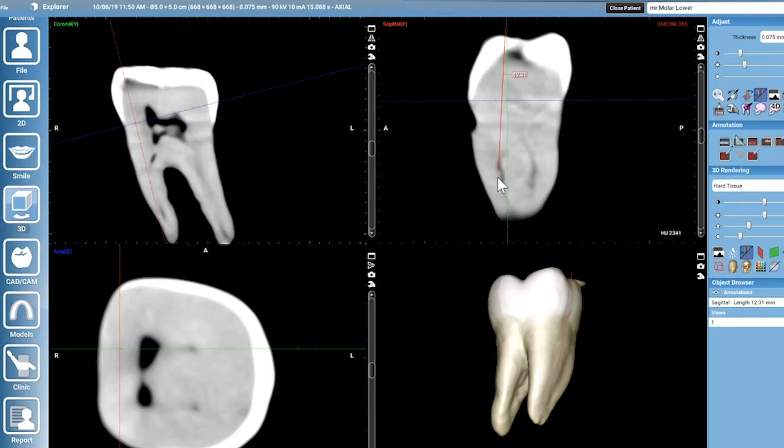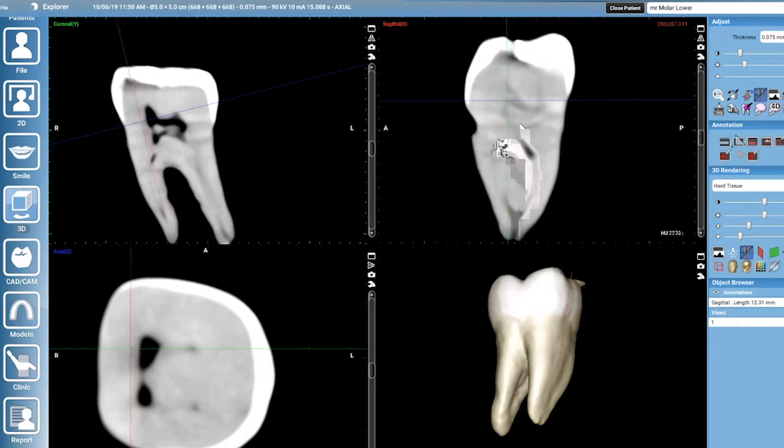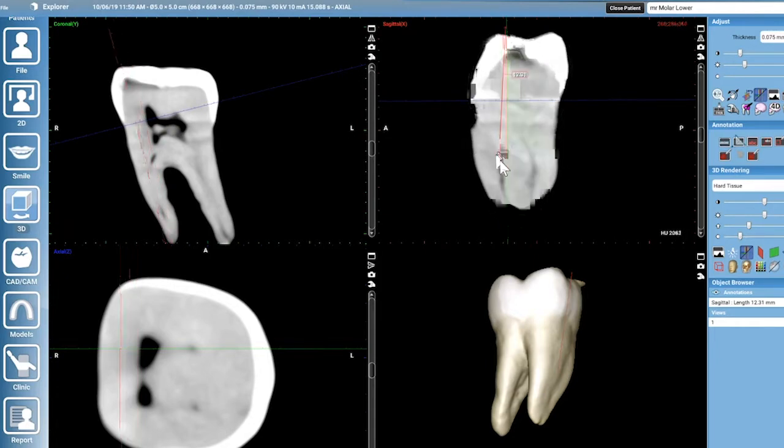So okay, once I realized that was what we were facing, I came up to the axis, shaped up a little bit straighter, a straight line axis without removing excessive pericervical dentin in this area, and then pre-bent my hand file. So this is a lingual buccal.